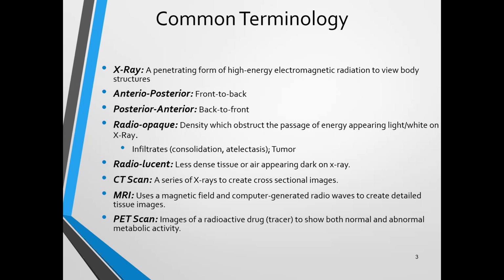What the mindset is, it'll light up because the cancer grows. By definition, it is the uncontrolled multiplication of cells. And then they reach a critical mass and they start producing a tumor, something that's actually visible, sometimes palpable. But what's going on there is this very, very rapid growth. Rapid growth needs oxygen, needs blood, and it needs nutrients. So the PET scan is emulating the actual nutrient part of that. And because it's tagged with radioactive isotopes, that can actually be seen. It can be, if you will, viewed.